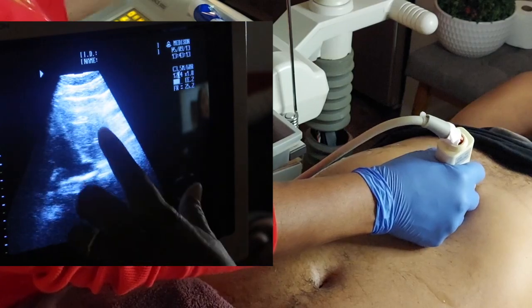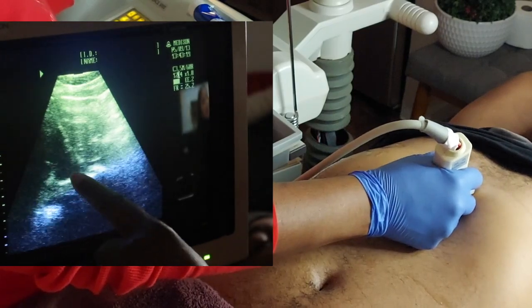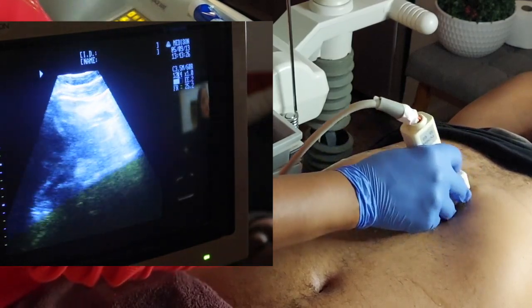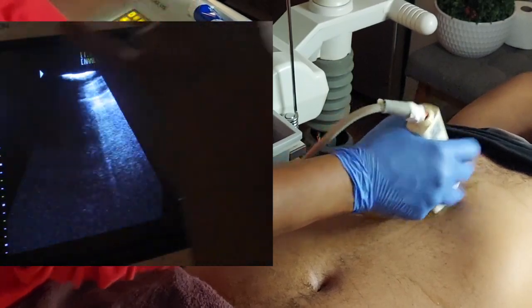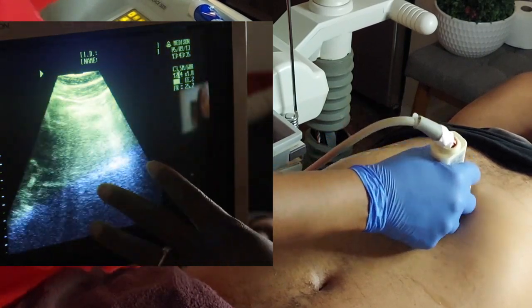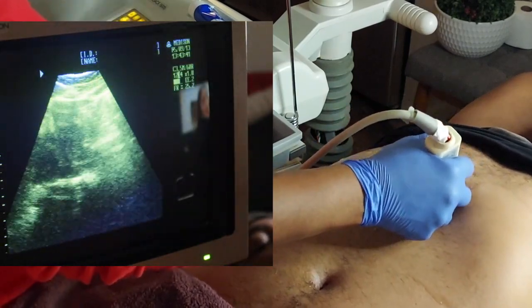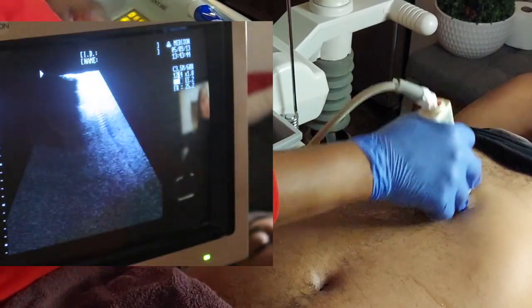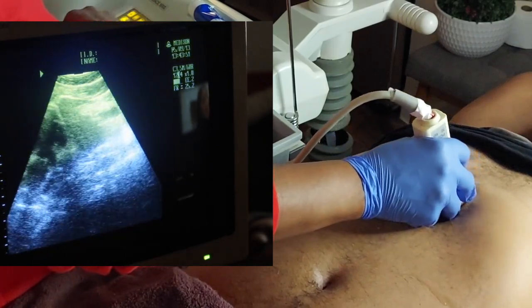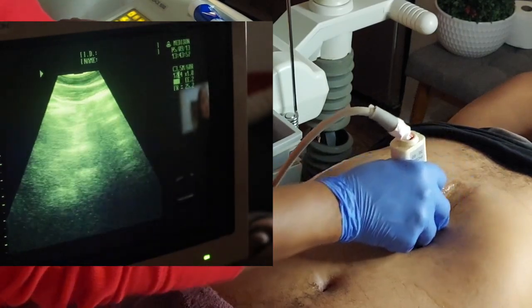Right now I'm looking at his left lobe, and you can tell that by here's his heart and the IVC is dumping into his heart. Don't pay attention to the resolution — a lot of hospitals might have an old machine so you're going to have to work with that. This is just to help you guys understand how to scan. So first things first, when I do an abdomen I start with the long IVC. Then I just turn my probe slightly and get the sagittal proximal aorta and I just follow that down.